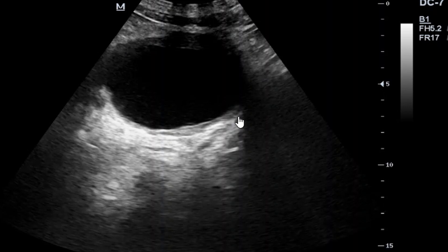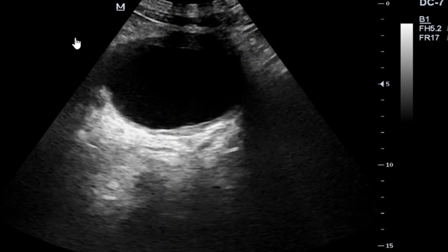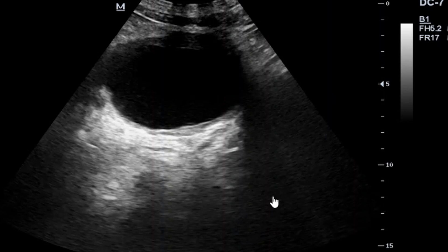Cystitis can be identified sonographically by a number of factors. You can see the thickening of the mucosal outline of the urinary bladder — the bladder walls can be thickened. At times you can also find internal echogenic particles in the urine. The infection can also spread to the kidneys, and when the entire system is affected we call that a urinary tract infection, or UTI.